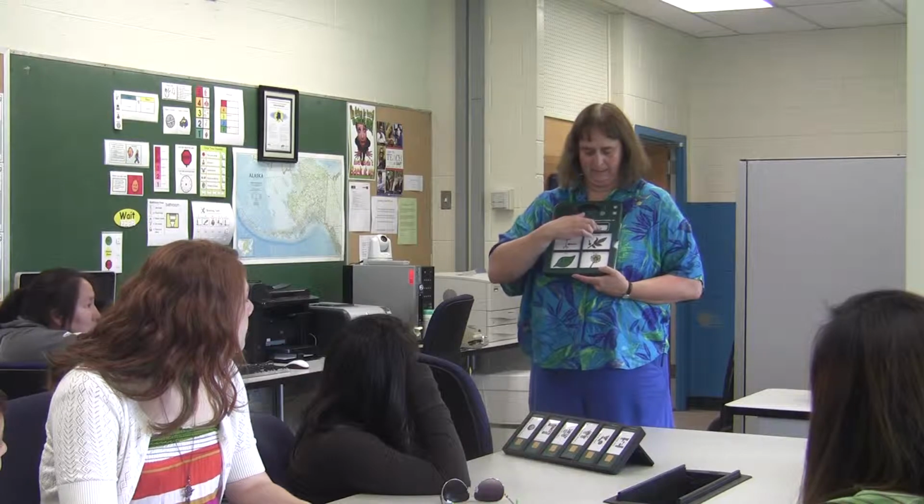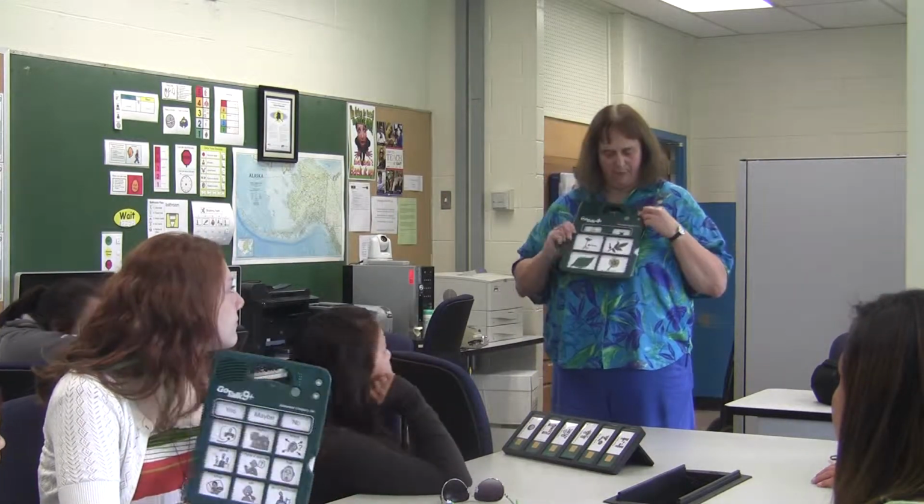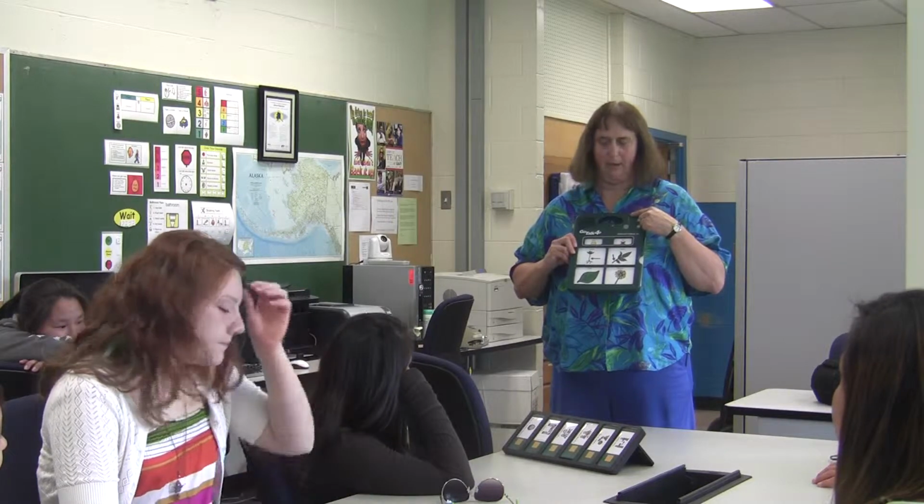Yes. No. So usually the top 2 frames are a yes or a no. I think the 9 has 3, and so maybe is in the middle. I'm not sure. And this has 5 different levels. So you can record 5 different cards.